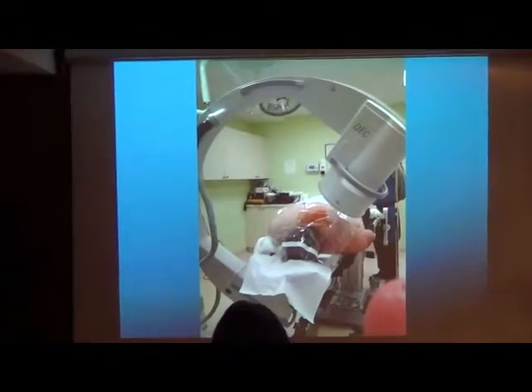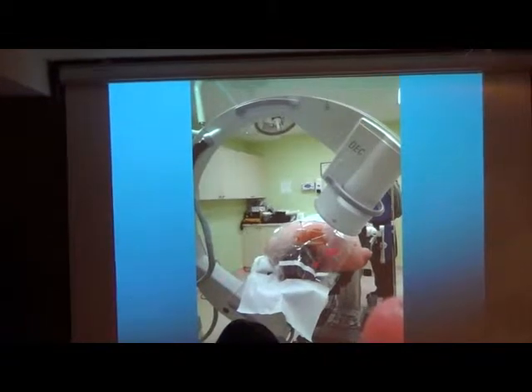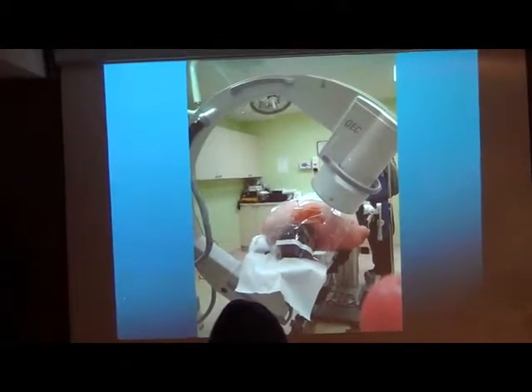This is also a typical patient for us. You can see the C-arm rotated for contralateral oblique fluoroscopy. Needle goes from the right to the left. X-ray tube rotated towards the needle, and the images fly away from the needle.